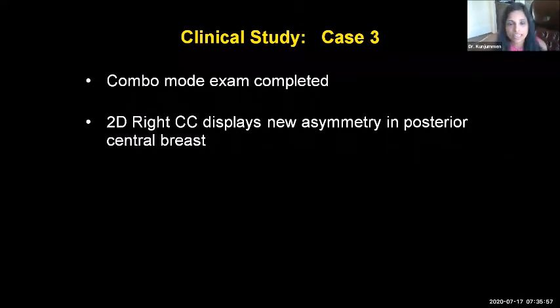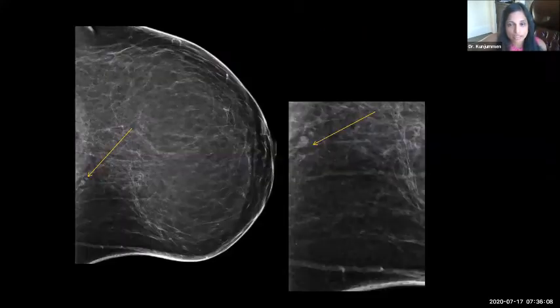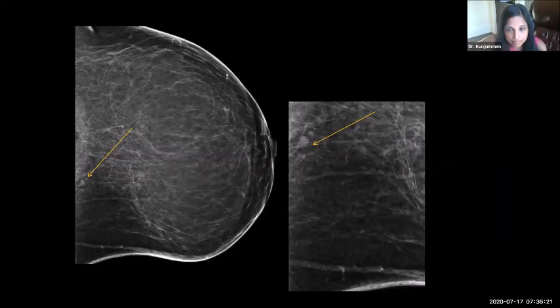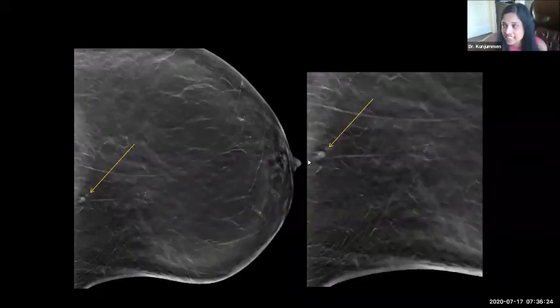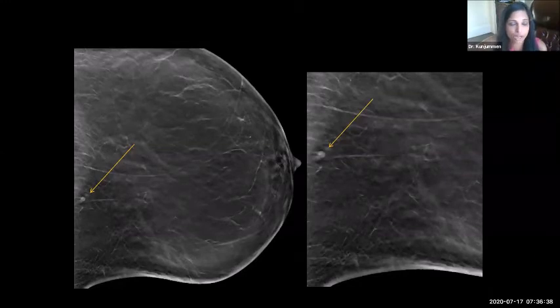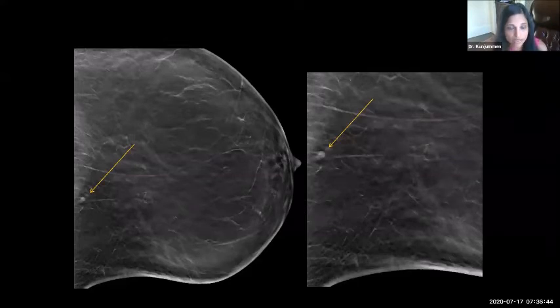In another case, on the CC view there was a new asymmetry in the posterior central breast. We would normally call these patients back. But with tomosynthesis, you can see this is an end-on vessel — just a blood vessel seen well on tomosynthesis. We don't have to call these patients back for additional imaging that would only tell them there is no abnormality, while increasing patient anxiety and driving up healthcare costs.